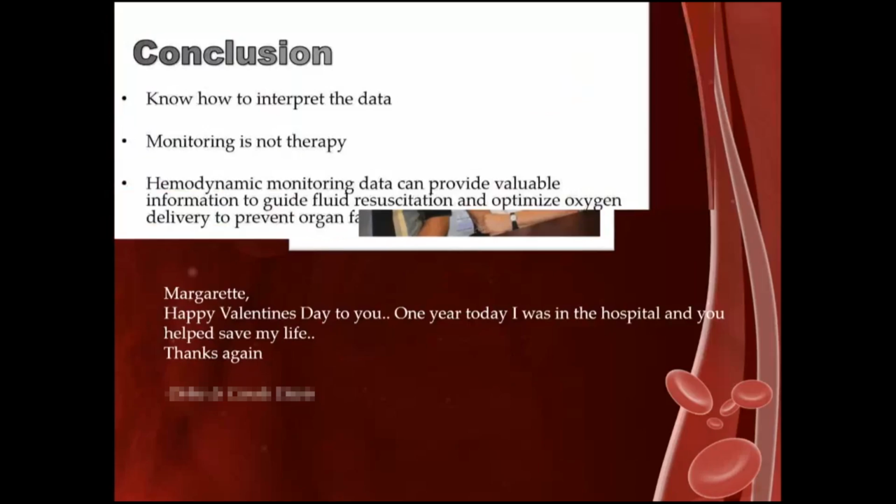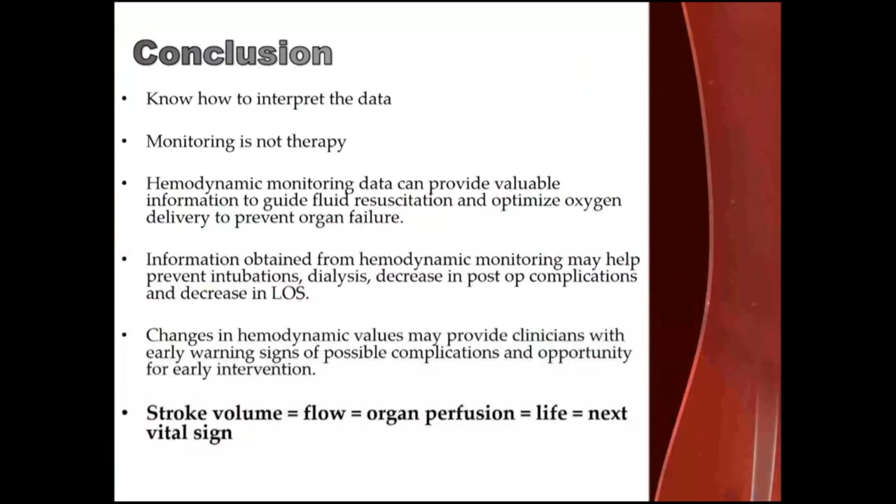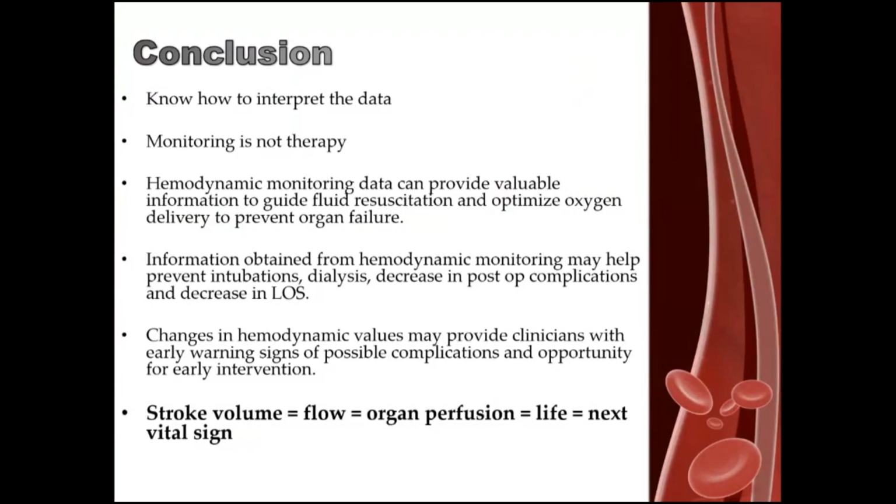Conclusion. Know how to interpret the data. Monitoring is not therapy. The fact that you have the monitor hooked up is not going to help your patient. You actually need to look at trends and the data, and if there are signs that you need to intervene, it's not going to get better if you don't do something about it.